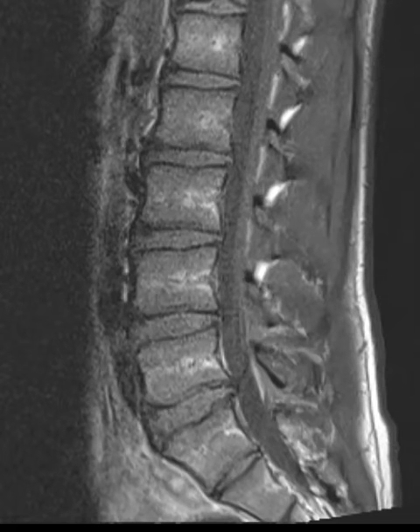Hello, this is Dr. Gay from First Sick MRI, and this is a 17-year-old male with low back pain, and this is a sagittal T1-weighted image.